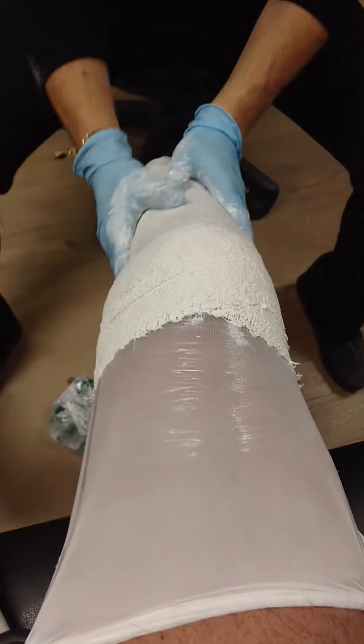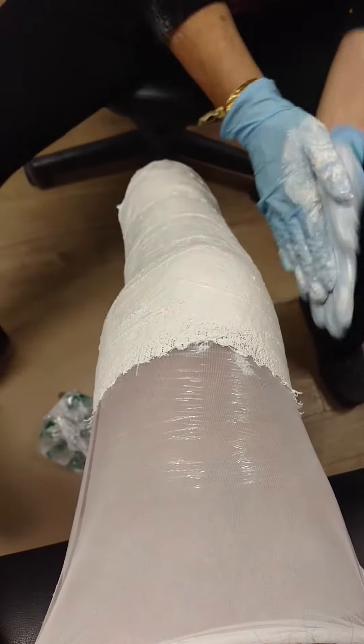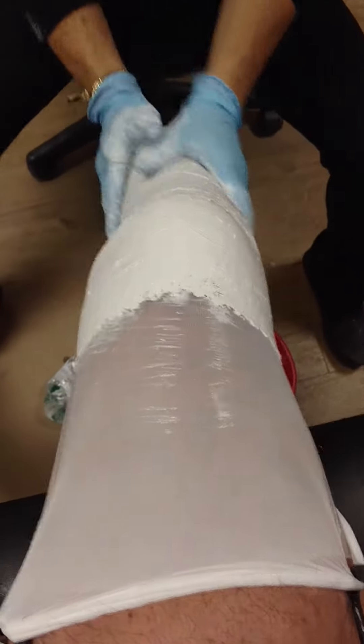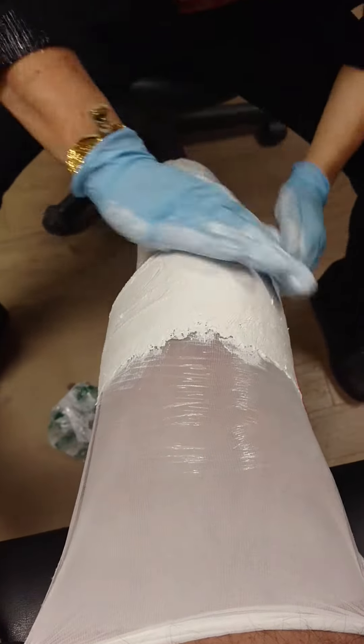These liners, like this one — we built an extra cushion for you at the bottom, so there's kind of a squish factor down there. And like if we were to take a scan of you with that thing on there, it does take up a little bit of room, but it's not a major thing.